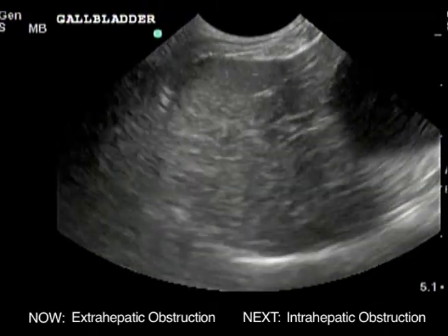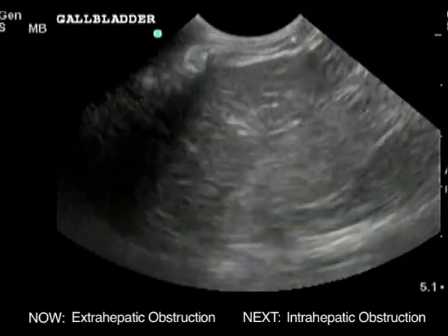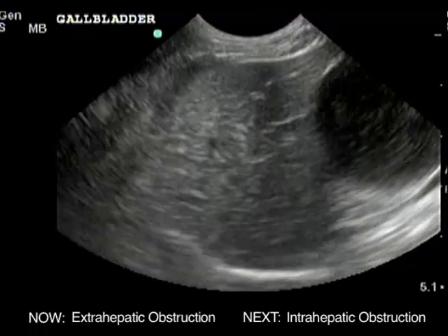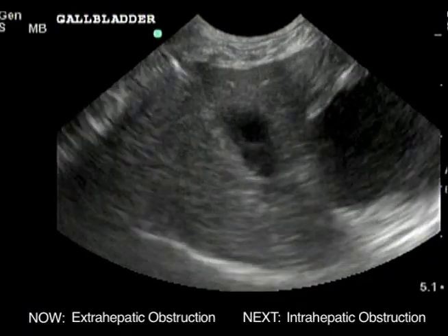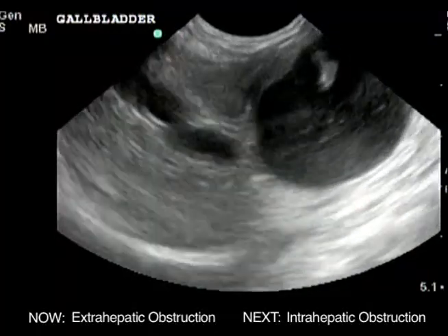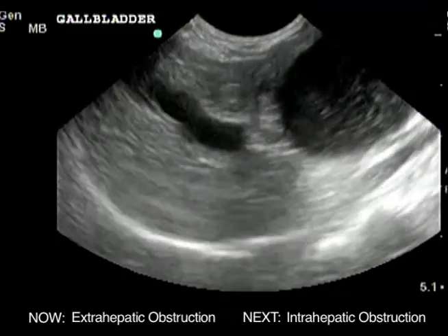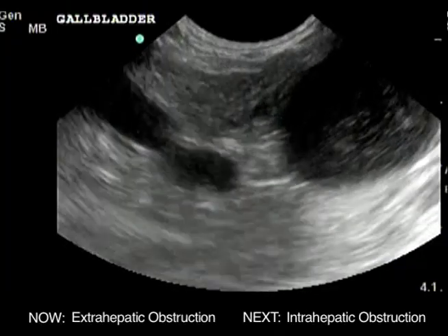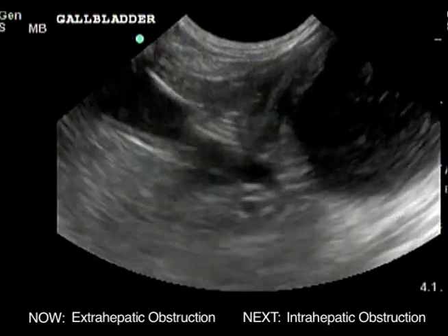This video shows the gallbladder of a 15-year-old spayed female cat weighing 6 pounds. This cat has acute pancreatitis with extrahepatic biliary obstruction. Cats with biliary obstruction usually have a strong and persistent contraction or spasm of the gallbladder wall. This causes pain and usually results in a rounded but not enlarged gallbladder. In one study, less than 50% of cats with biliary obstruction had gallbladder enlargement.